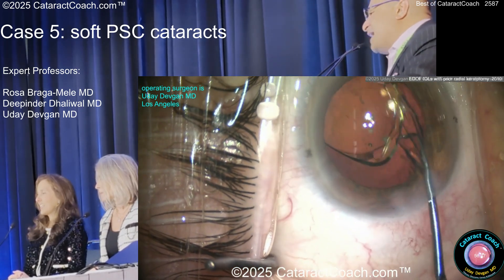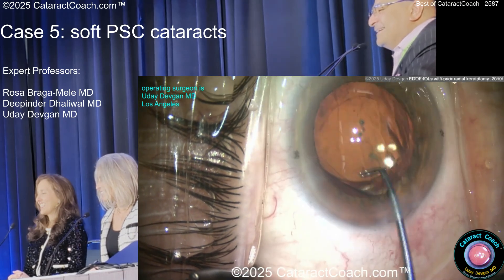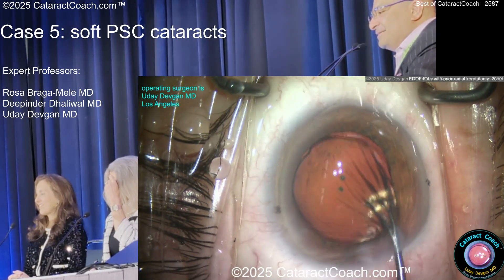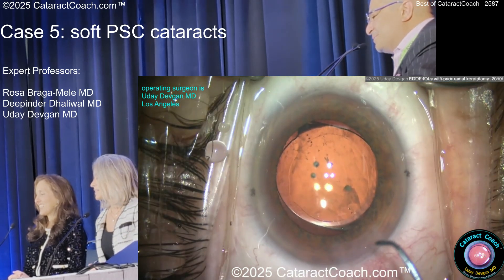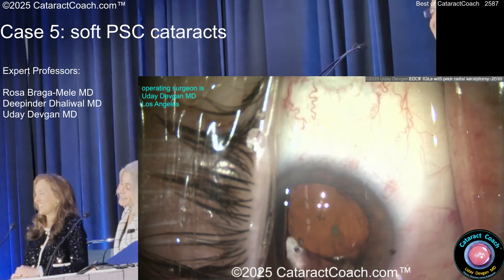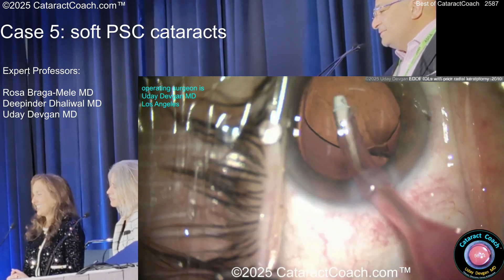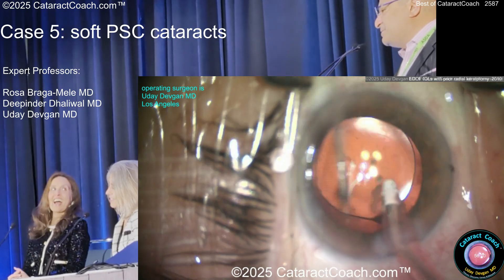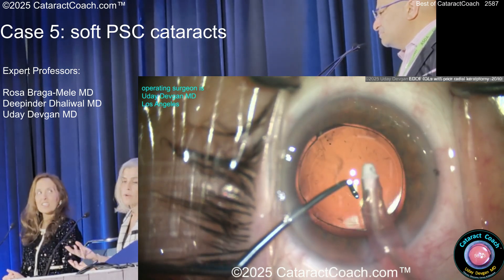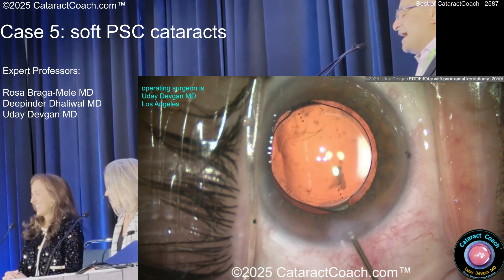Now I have a lens in — can I just pick at it a little bit? Can you just stop? Please? It's a toric lens too, right? So I definitely don't want to break the bag. I told you you'd scold me. Maybe I'll go under here — can I just grab that thing? I can't watch. I got it! Oh, don't. I just had to try one last time. It's still bugging me. If it's really bugging you, just go in with Vannas scissors or MST scissors and truncate the free part. Or you could start your posterior rhexis that way too, in case you mess up. The post-rhexis.